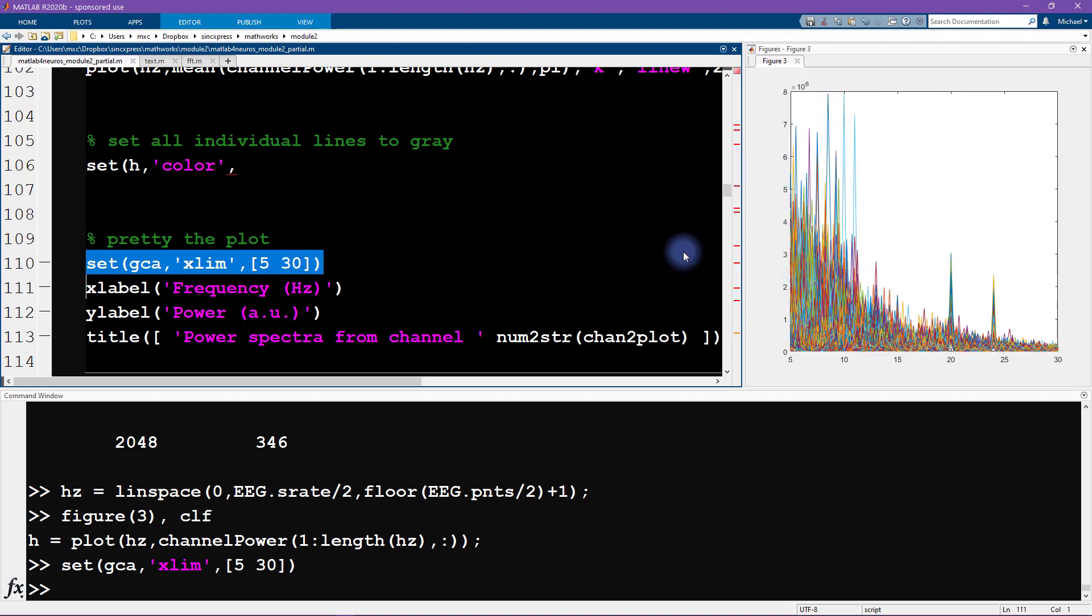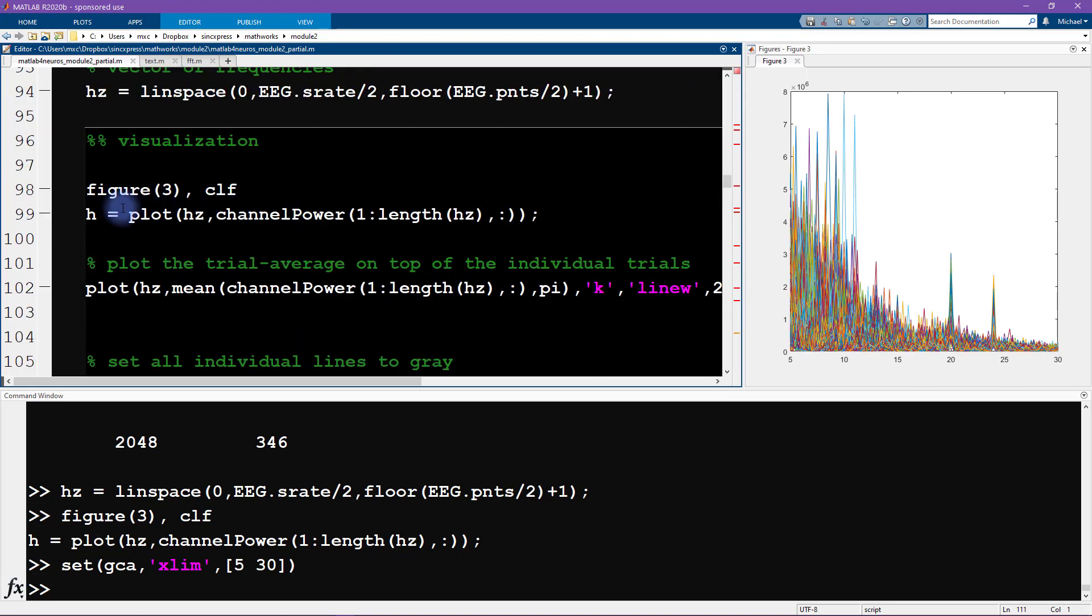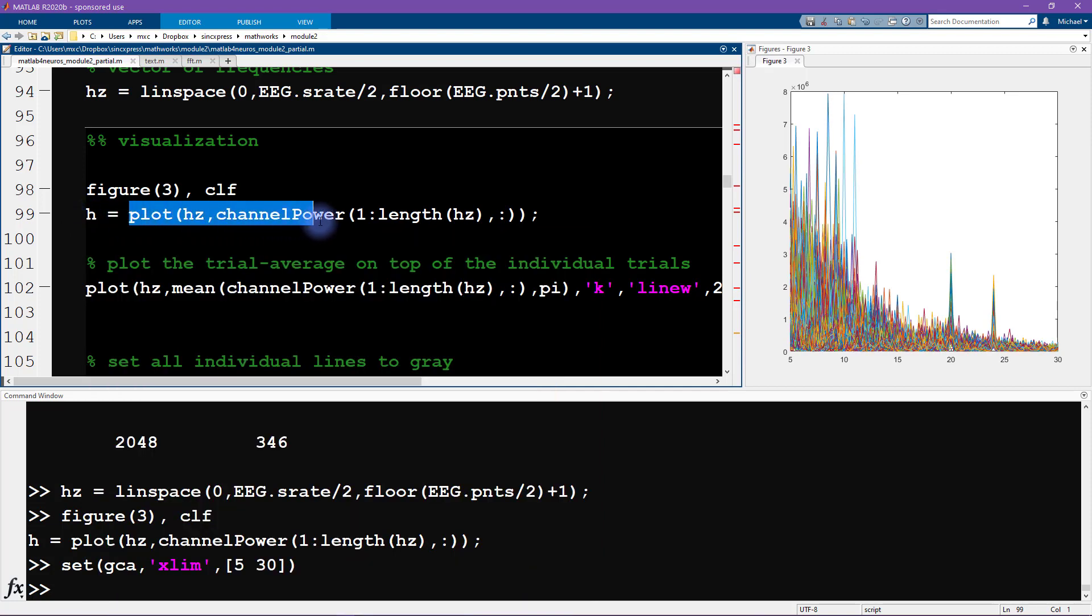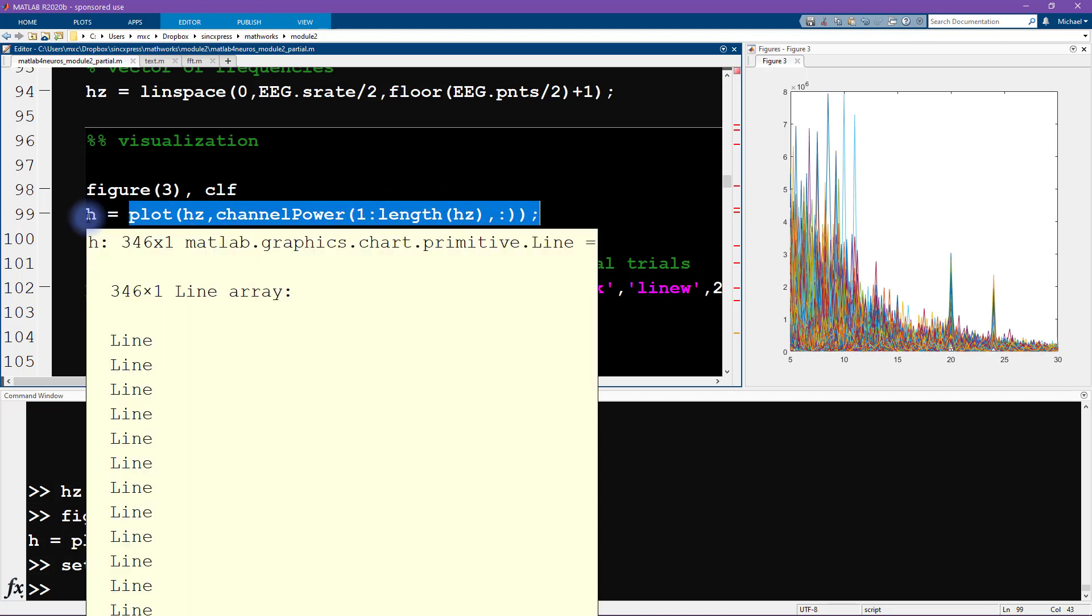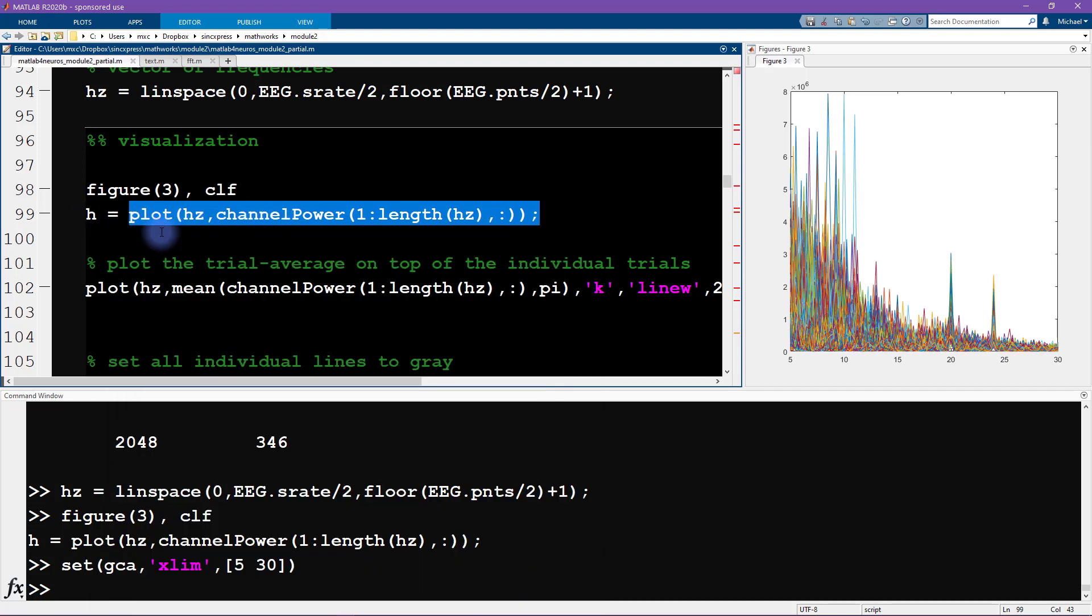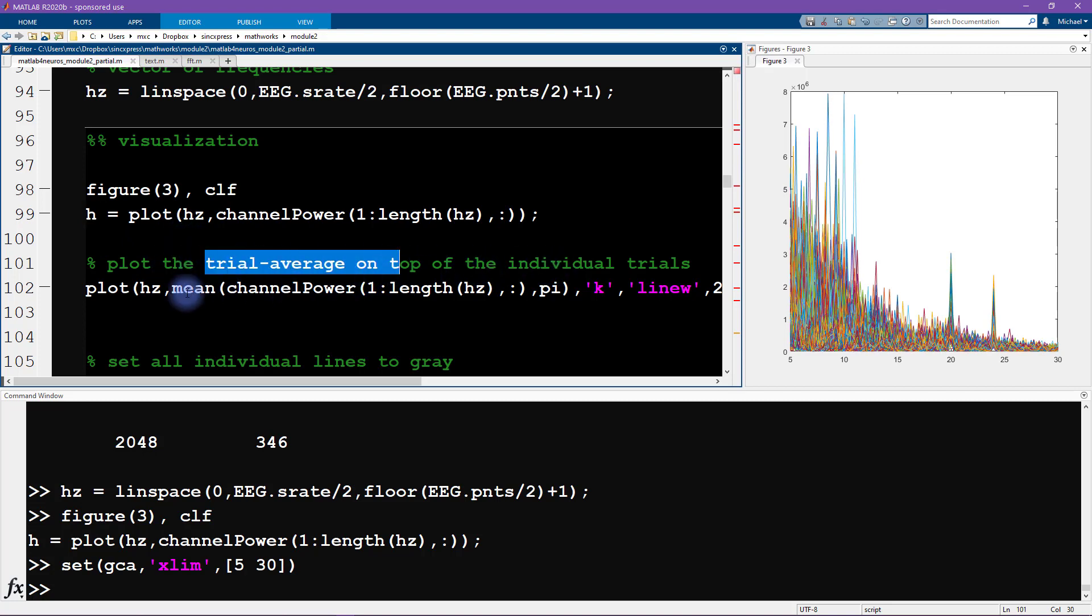Now these lines are not light gray, the way that I showed in the slides. We're going to need to adjust the colors. We're going to adjust those colors using this variable h. This h here is called a handle. It's a handle to each specific line that is being plotted here. You can see that there are 346 of these corresponding to 346 trials. In a moment, we are going to change the color of all of these lines at the same time using this plot handle variable.